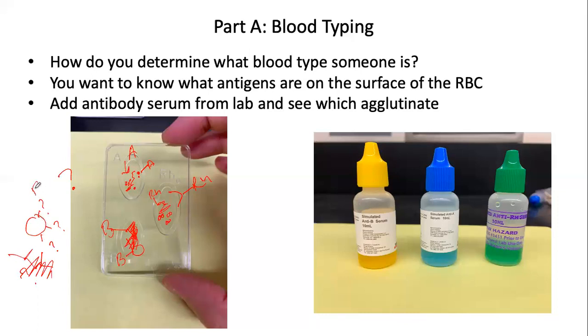So if I have B antigens and RH antigens, sorry, it's my cat again, because that's what agglutinated when we added those antibodies, the synthetic antibodies or the antibodies we ordered, then we can assume that we're going to have A antibodies in that person's plasma, right?